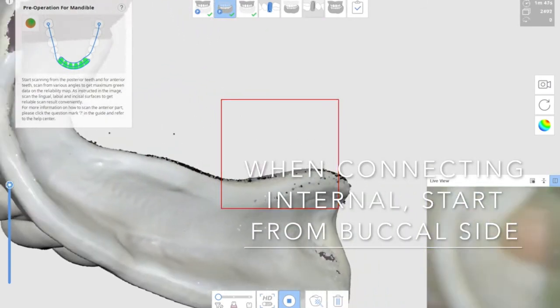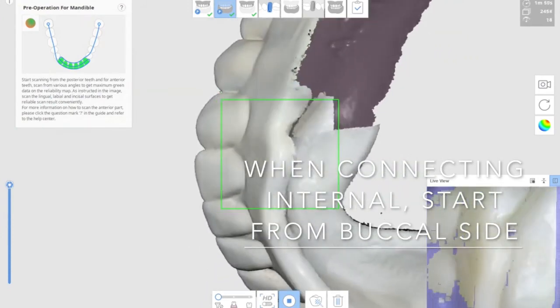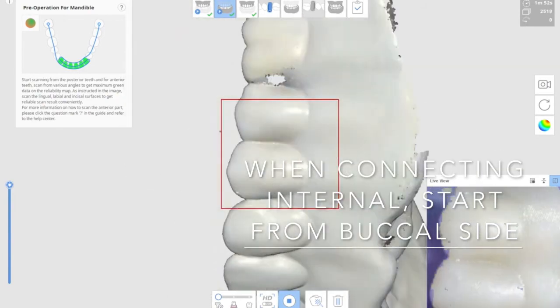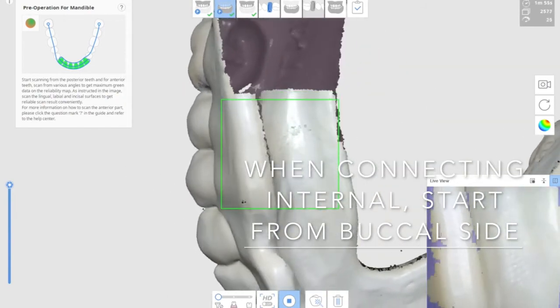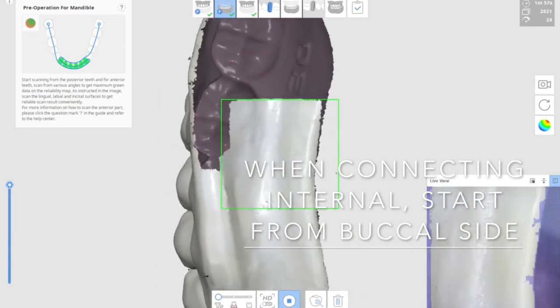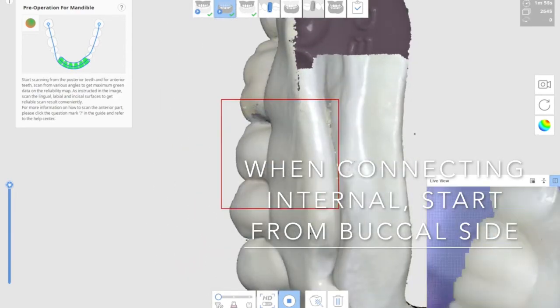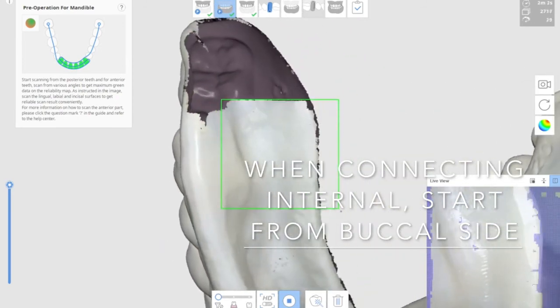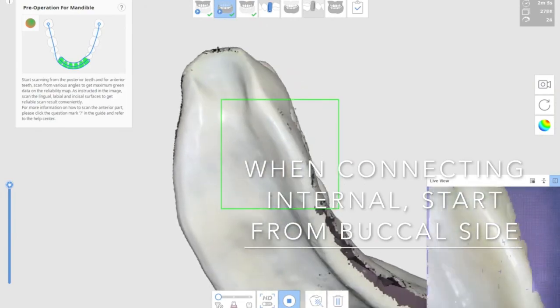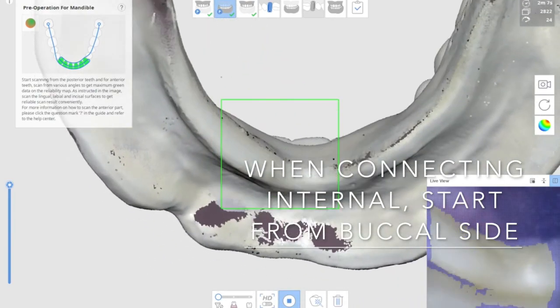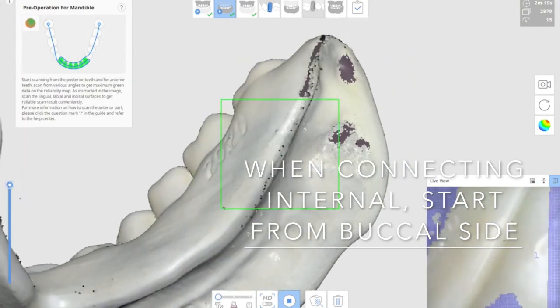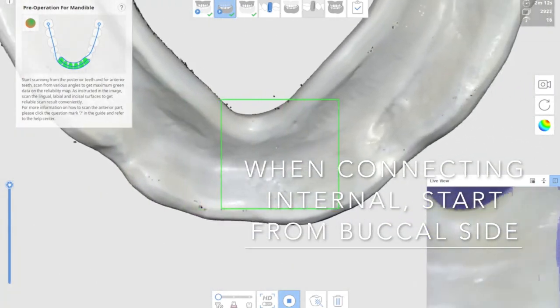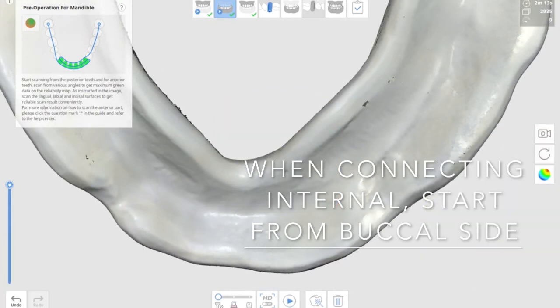This again will prevent possible mismatching by revisiting different surfaces at different times. Start from the teeth and that will allow the software to understand where we are scanning it, and then complete internal surface scanning. If you follow this sequence, you could complete edentulous try-in model full scan on the outside and internal surface.